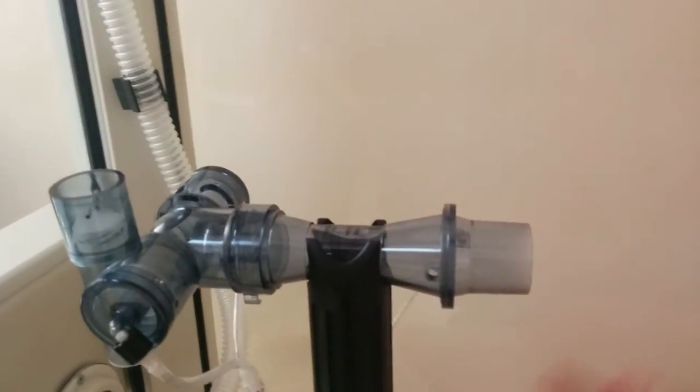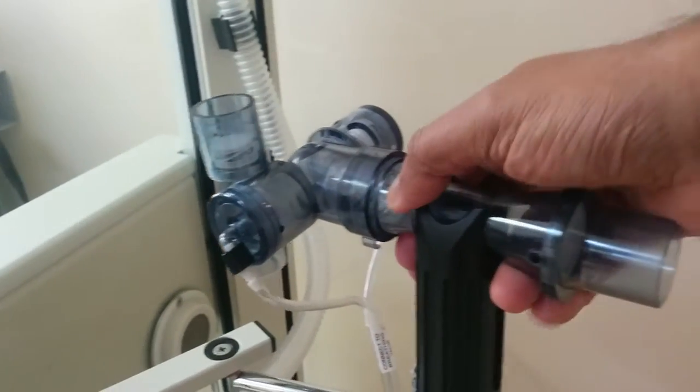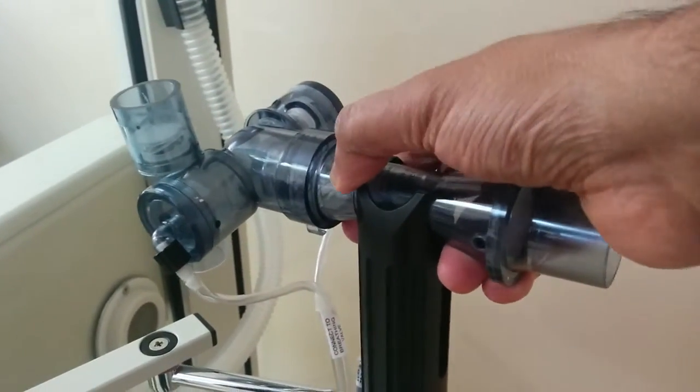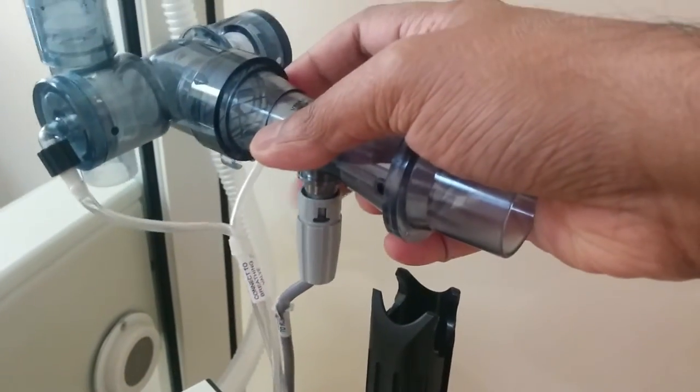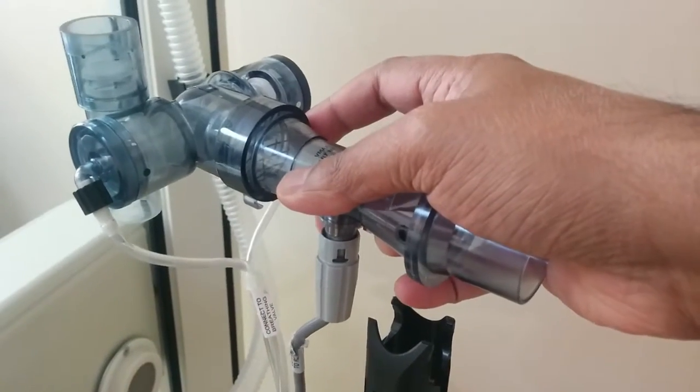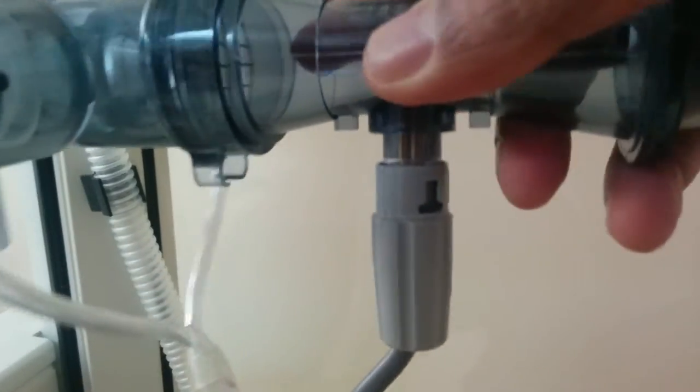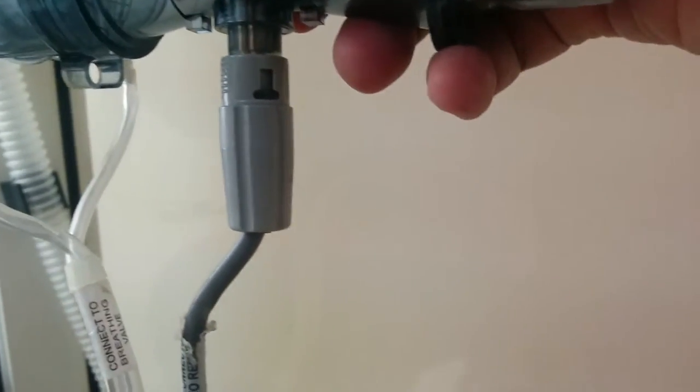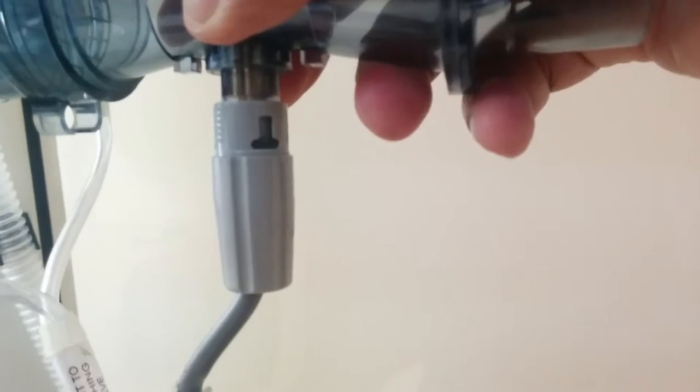You need to take off all these parts that are attached to the flow sensors and pull this out like this. You see this part here, this one has to be unplugged. How you do it is there are these words that say press.